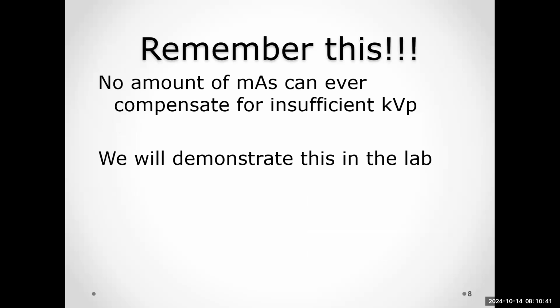It would be like if you had 1,000 soldiers, okay, you can relate to this because you're military. You have 1,000 soldiers, but they're all 90 to 100 years old, and they're fragile, and they're weak. Are they really going to do you a whole lot of good? Probably not. So it's the same thing with the photons.